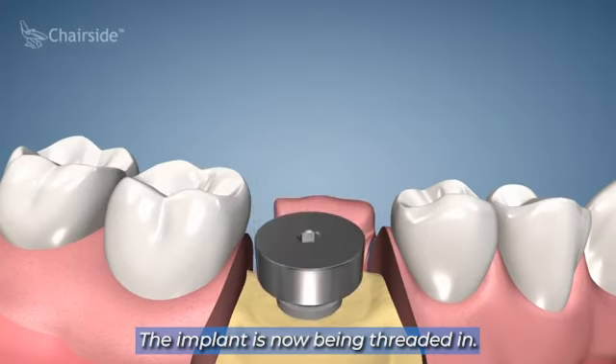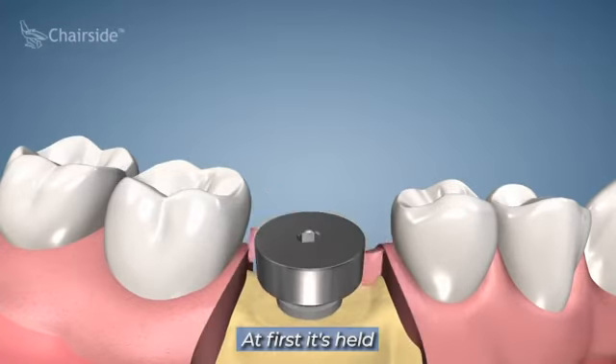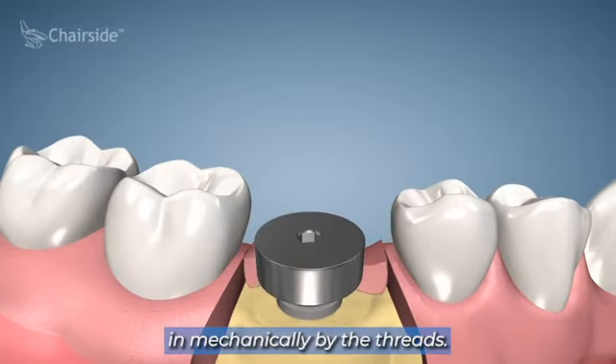The implant is now being threaded in. Over time the bone will grow into the implant. At first it's held in mechanically by the threads.